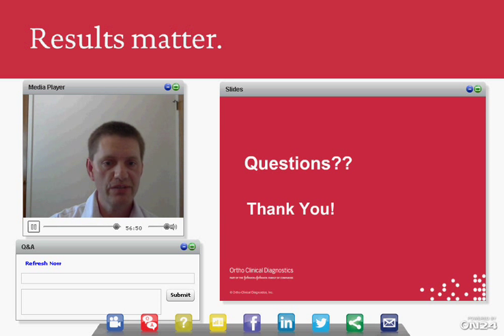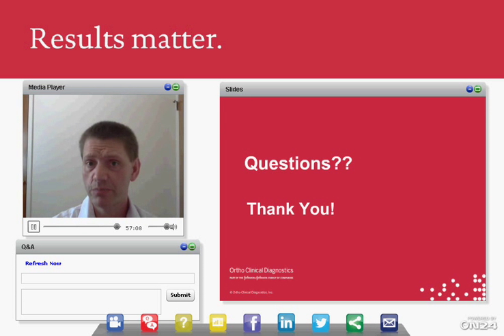Okay, comment about sample size for neonate and point-of-care testing for total and conjugated bilirubin, VITROS BBC slide assay. The BBC slide utilizes, I don't know the exact volume, but it's around 10 microliters.